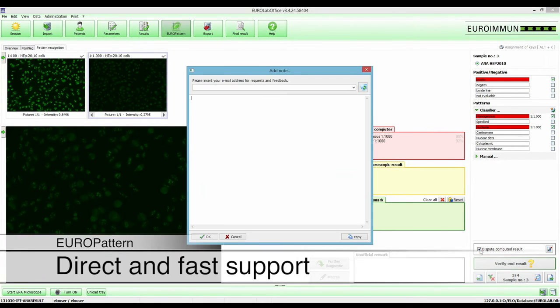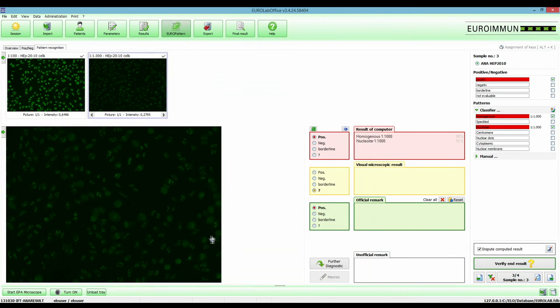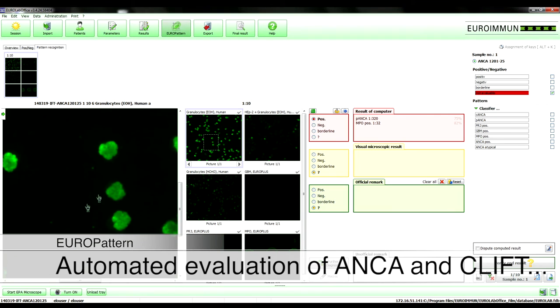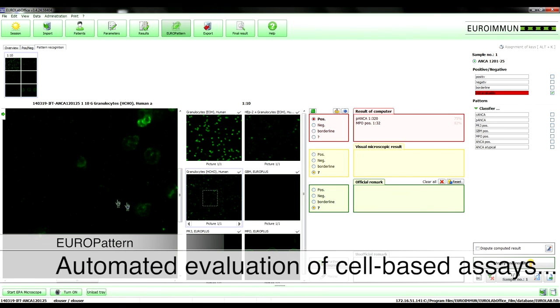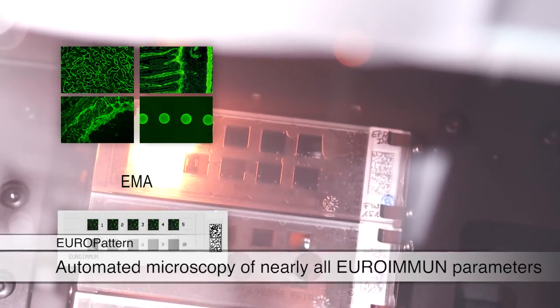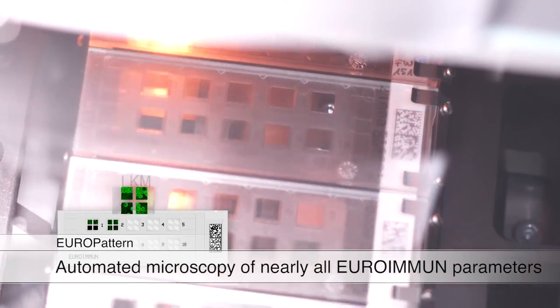In case a technical or diagnostic question comes up, the EUROIMMUN expert support can be requested directly per mouse click from the result overview. Automated evaluation by EuroPattern is available not only for ANA and ANCA but also for CLIFT and other analyses. Automated image capturing for subsequent on-screen diagnostics is possible for virtually all further EUROIMMUN parameters.